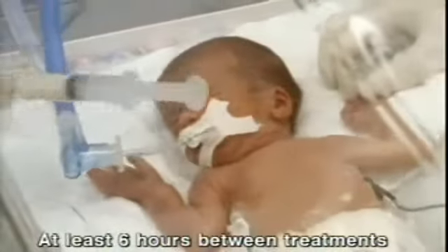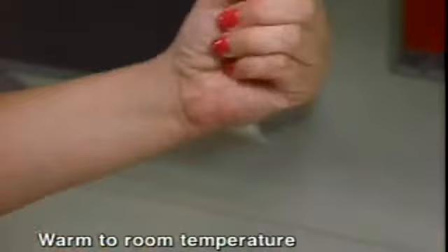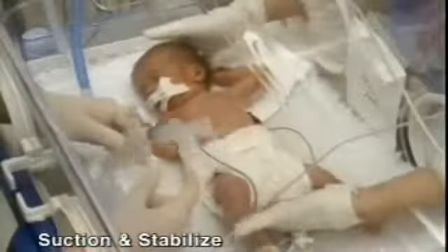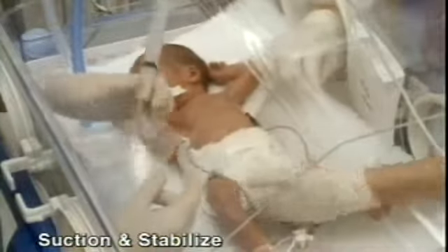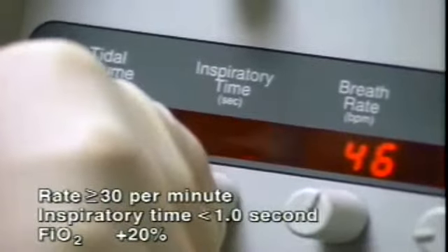Retreatment with Surfactant is virtually identical to initial dosing. However, wait at least 6 hours between treatments. As always, be sure to warm the drug to room temperature for each treatment. And make sure the infant is suctioned and stable. Adjust the ventilator settings each time.